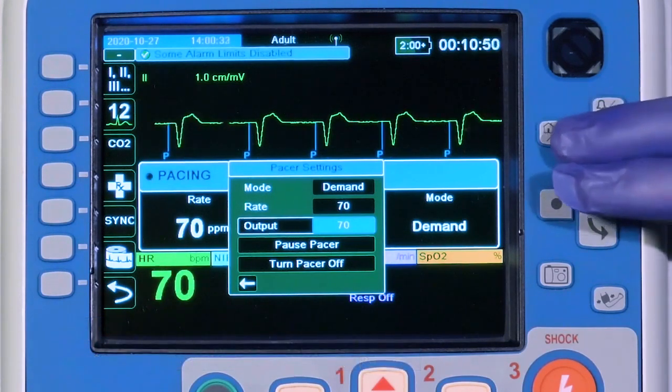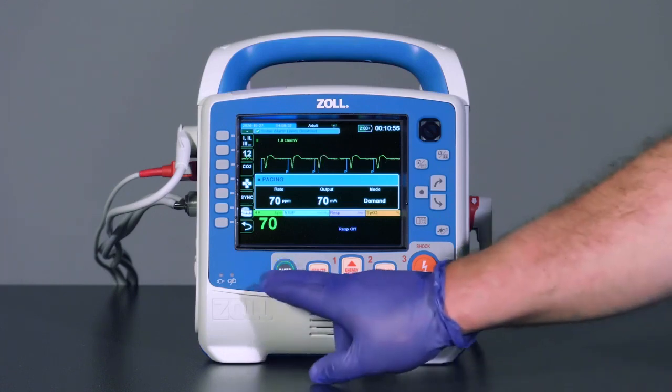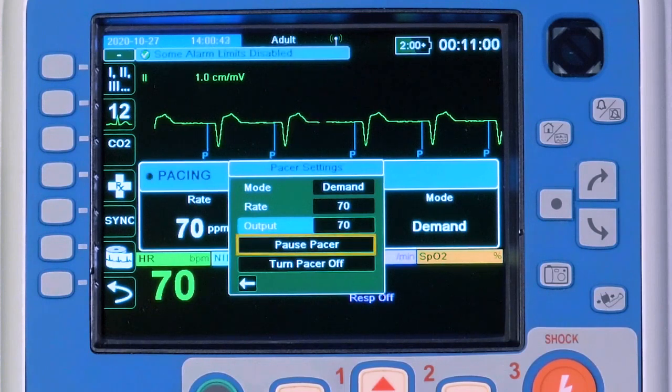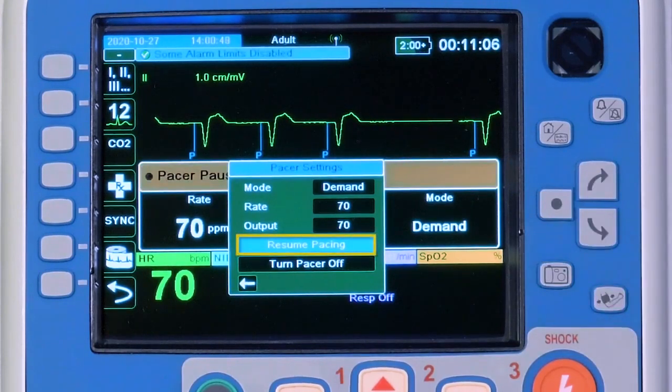Selecting either Home or Pacer buttons will remove the pacing menu. The pacing menu can be accessed again at any time by selecting the Pacer button. In the pacing menu is an option to pause pacer. Pausing the pacer results in an indefinite pause. Select Resume Pacing to resume.